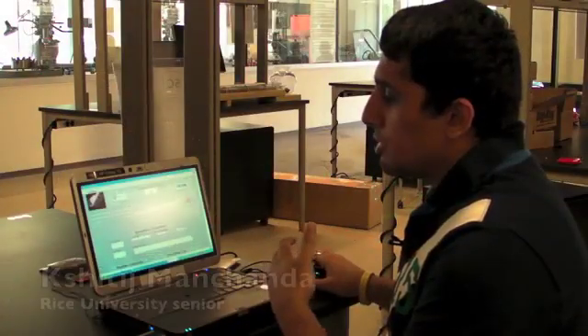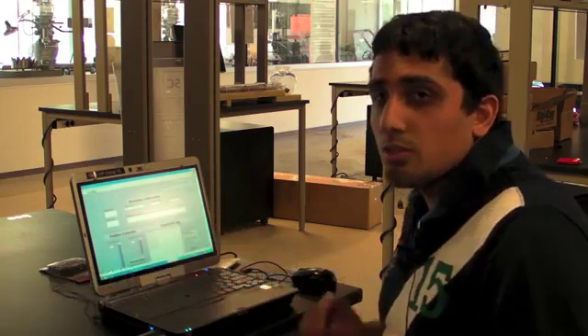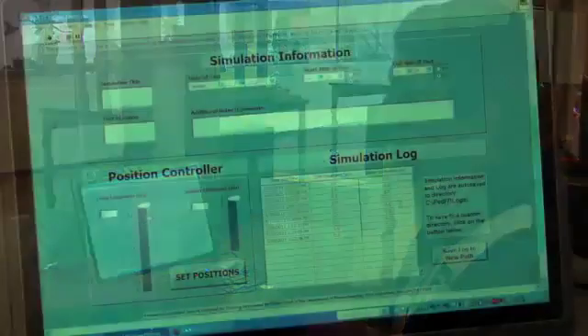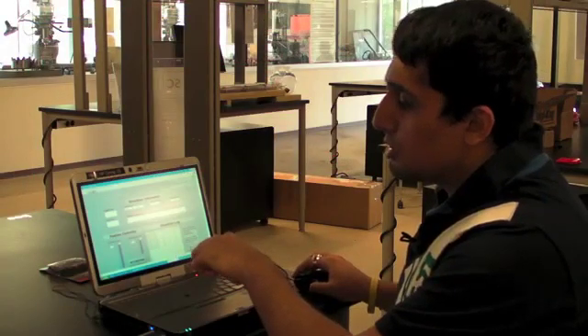We've allowed the user to move the liver and spleen as demonstrated. The liver can move anywhere from zero to five centimeters and the spleen from zero to three centimeters. The user has the ability to toggle this position through either a slider or by entering the numerical value directly.